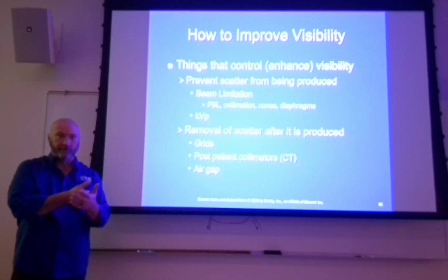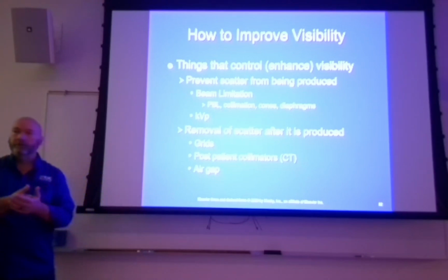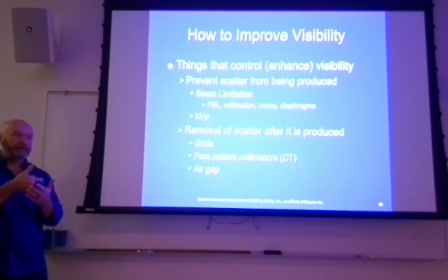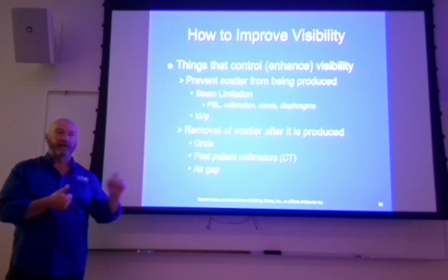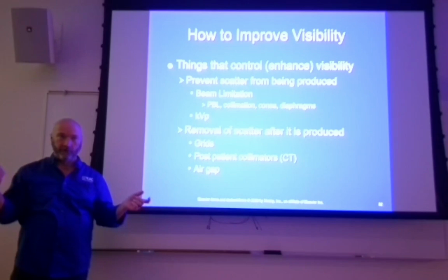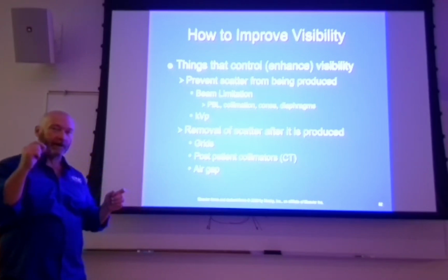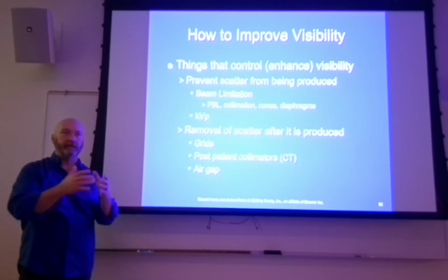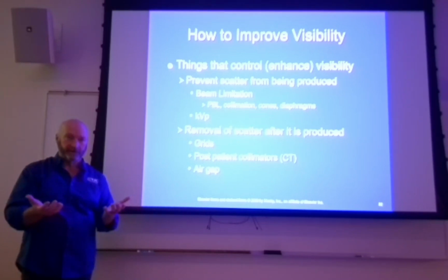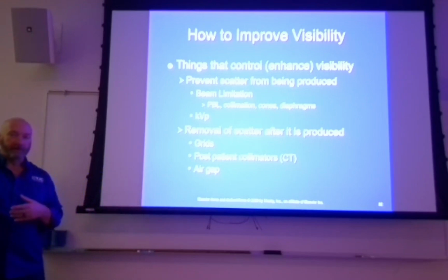So if it receives X-ray photons below that level, then it knows that that's scatter radiation. It just disregards it. It picks that out and throws it away, and says, we're not going to use that in the analysis and creation of this image. So it works like a grid, but it only selects those very low kilovoltage X-ray photons. Does that kind of make sense?